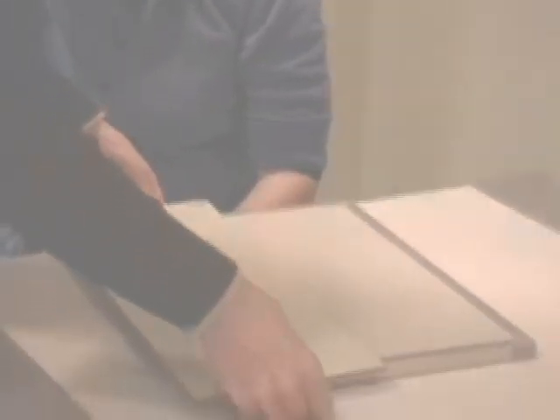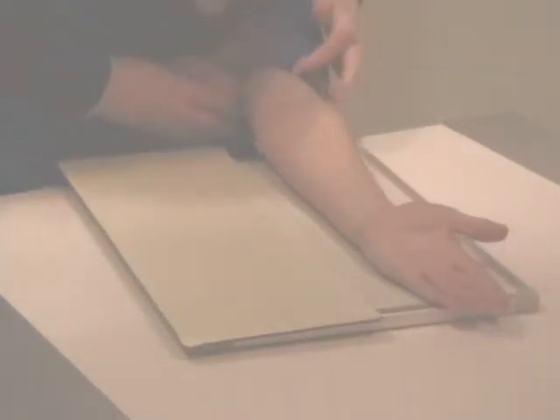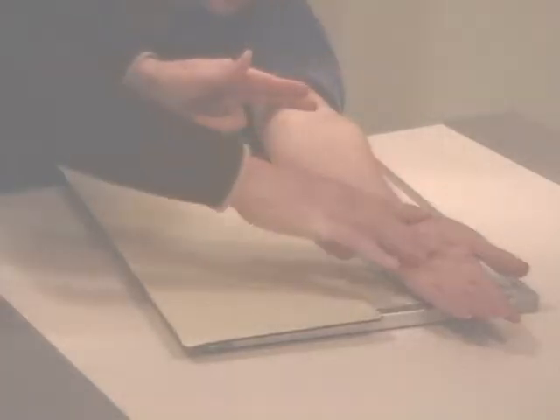We'll just do this real quick for you. It's the same criteria that we talked about. I'll just recap real quick. Proximal forearm, AP there, no foreign objects on, and I'm going to have the elbow joint 1 inch from film, or excuse me, 1.5 inches from film's edge because of her arm allowing that.